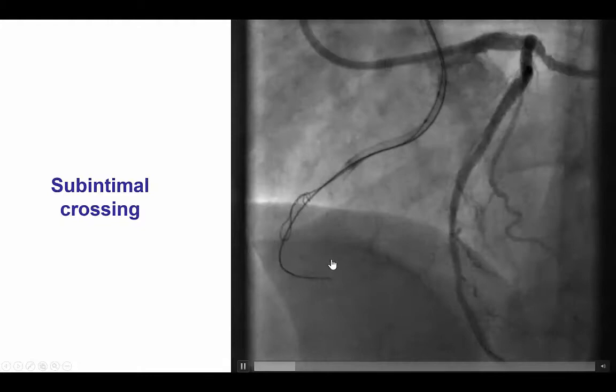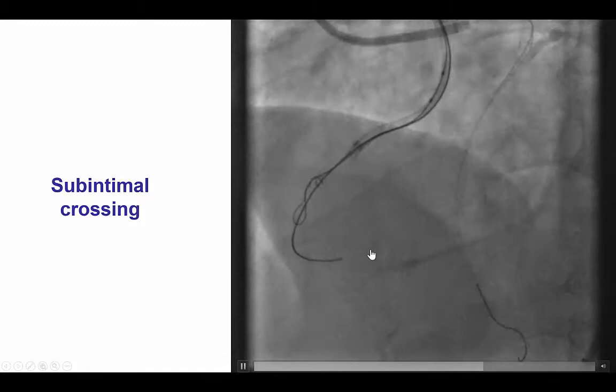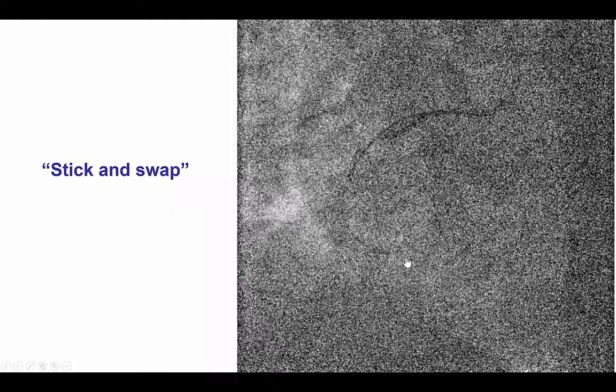We were then able to easily advance the Corsair all the way to the distal right coronary artery. We were, of course, subintimal as we knew, but we were moving in sync with the distal target vessel.